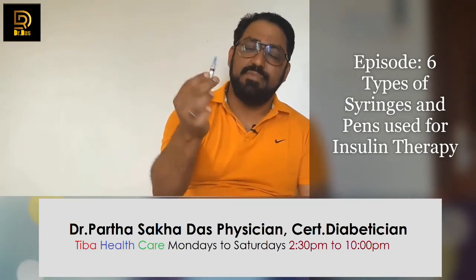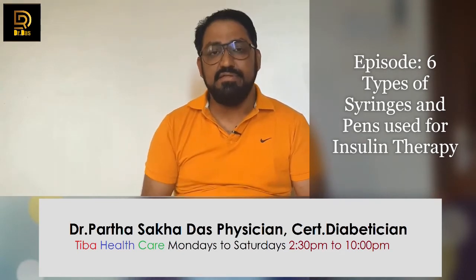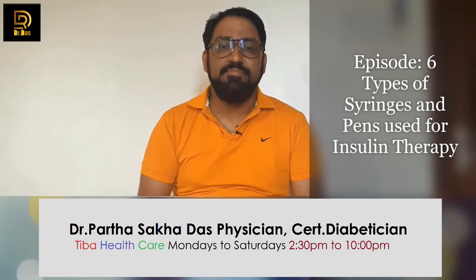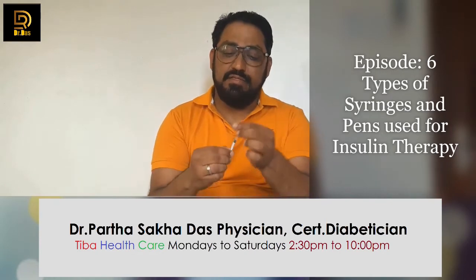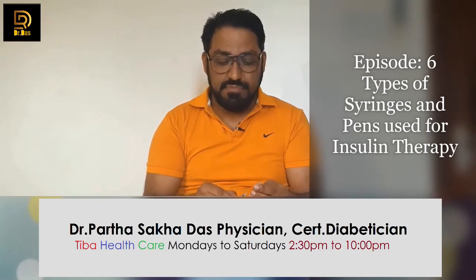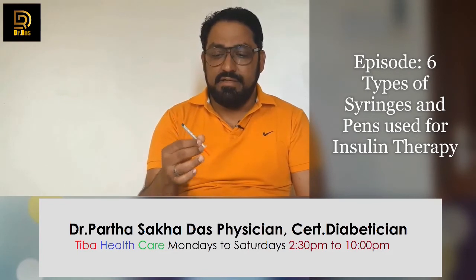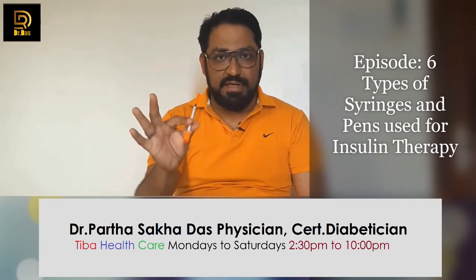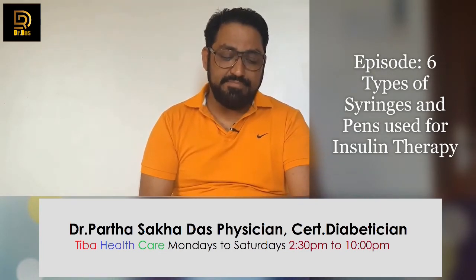Now when we think about an insulin syringe, we usually think of a big syringe like that. But this is not actually the reality. The syringe for insulin is very thin. Many people don't even feel it when you inject. It looks like this, and the syringe is very small. This has been in the market for a long time, and usually you use it and throw it every day. After that, the flexi pen came to the market.